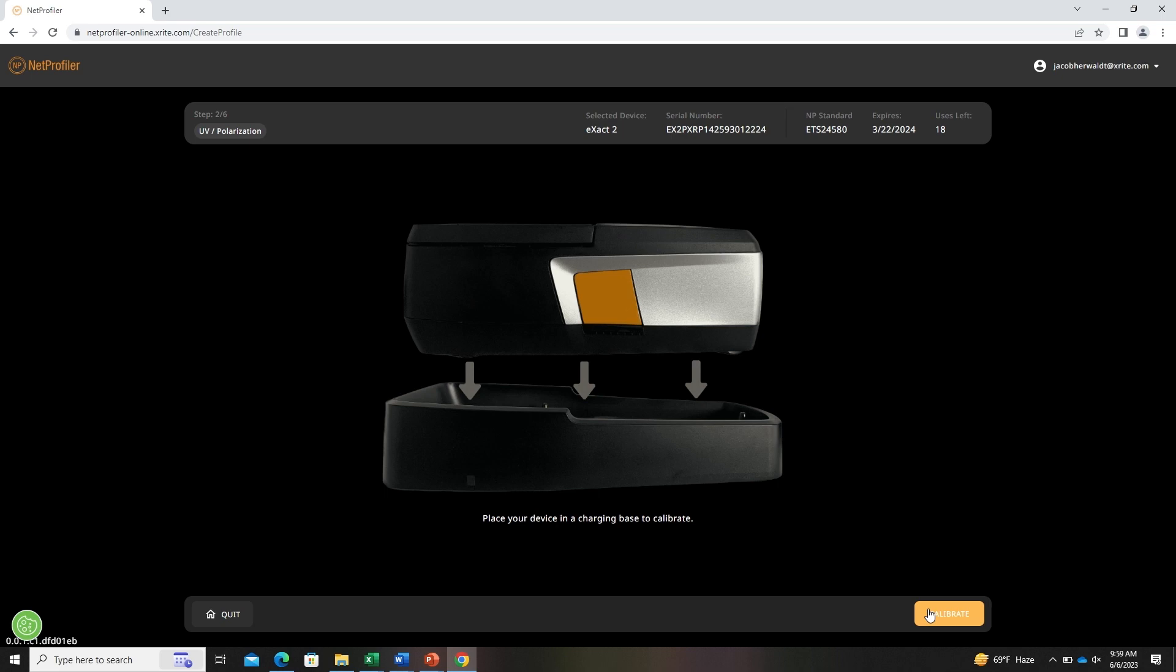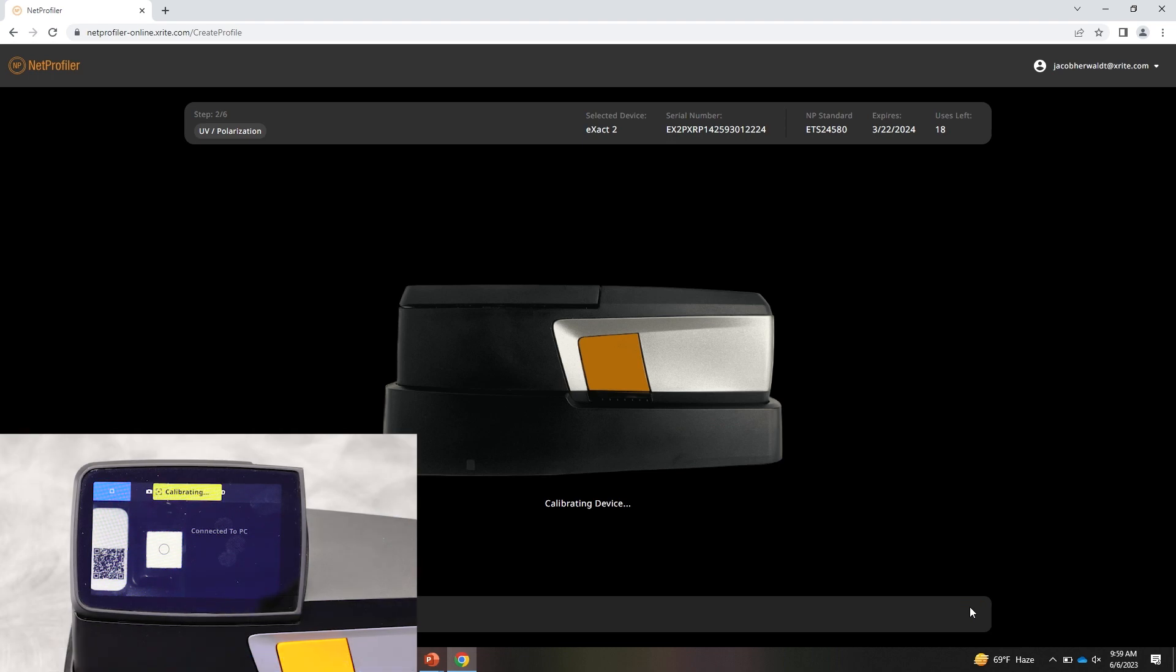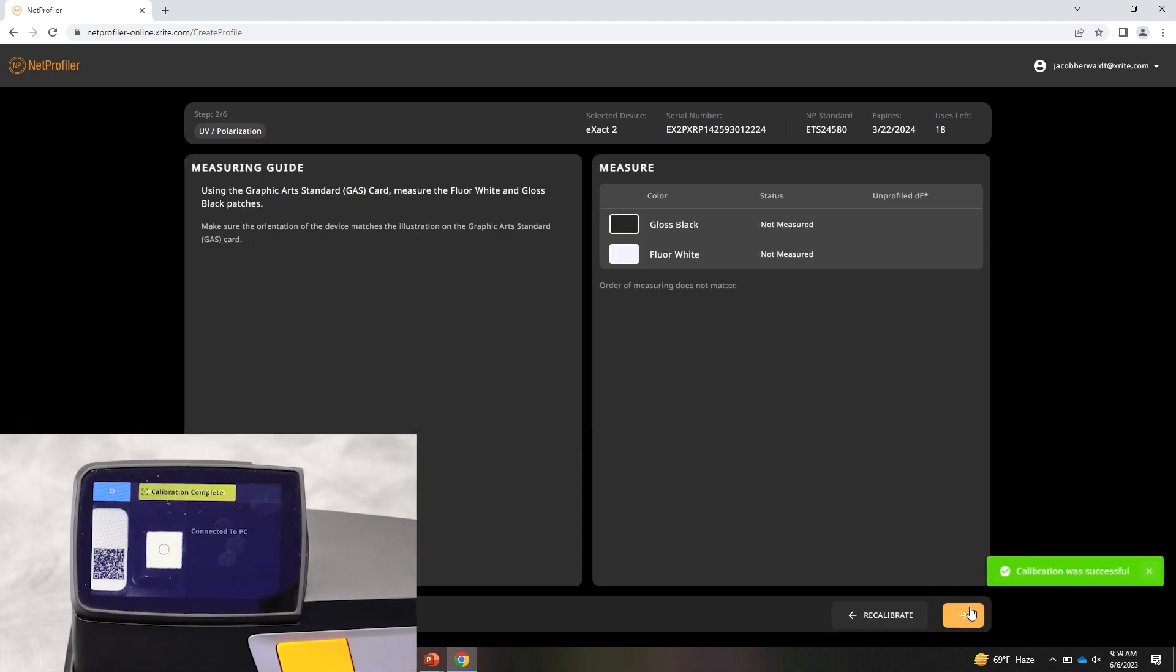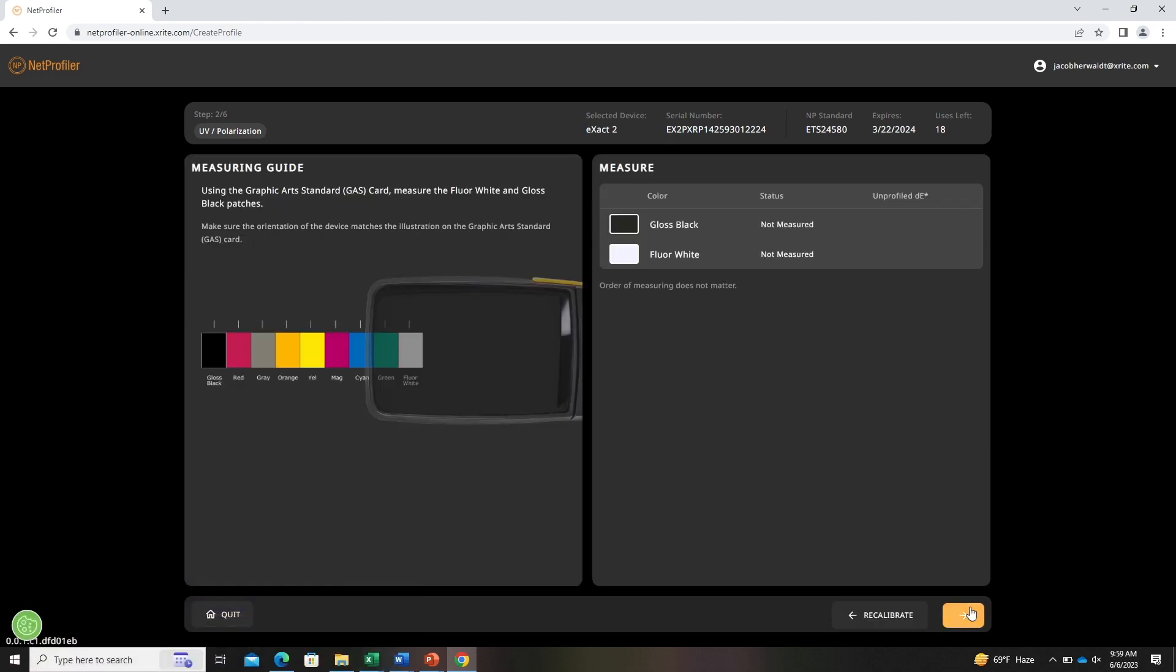Now we'll start by calibrating the device. So in the software you will click calibrate. This will force the device to start calibrating. Once successful, you can then move on to measuring the standards.